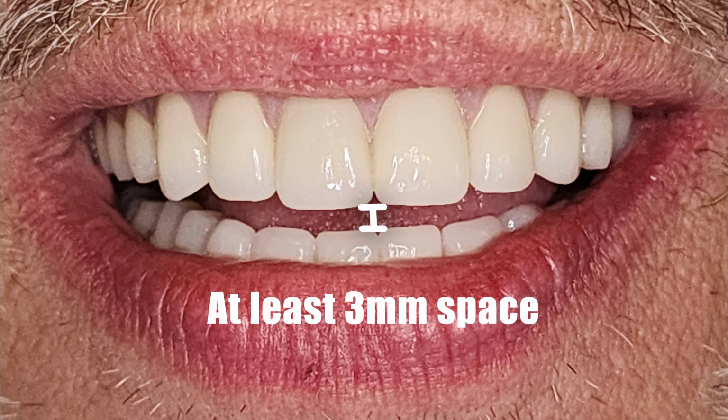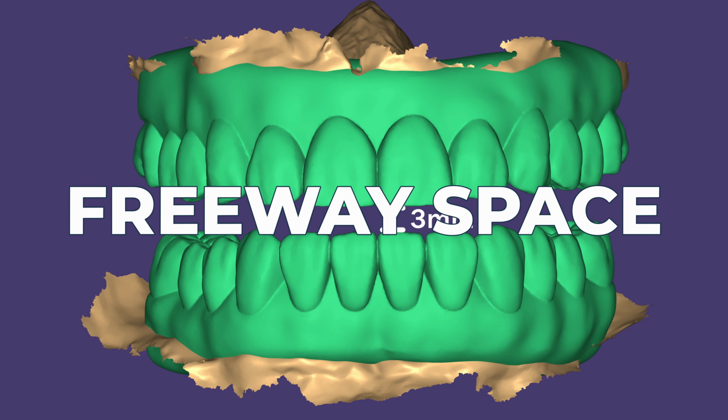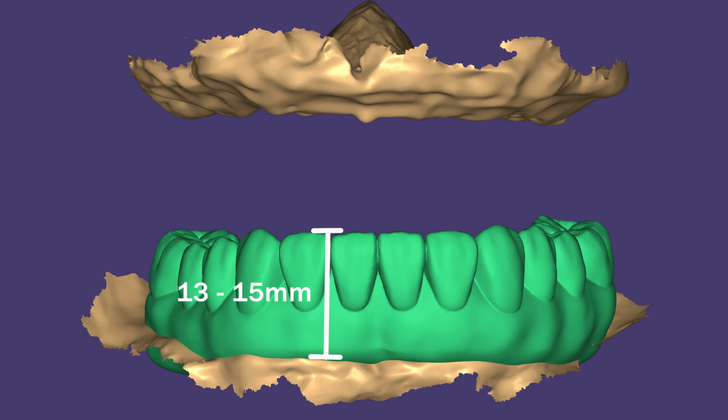So once again, once we know where the edge of the upper teeth will be with the jaw at rest, we want to plan for the edge of the lower teeth to start 3 millimeters below that. This makes what is called the freeway space. The reason is when the mouth and jaw are at rest, the upper and lower teeth are about 3 millimeters away from each other. And just like the uppers, we plan for the lower dentures to ideally be about 15 millimeters in thickness, but 13 at the minimum.